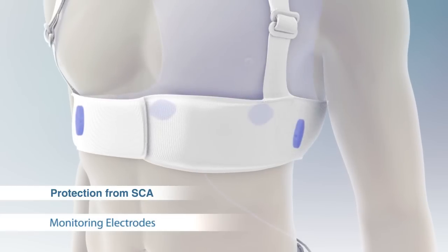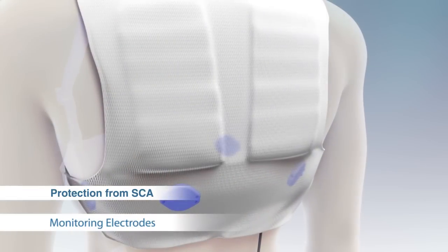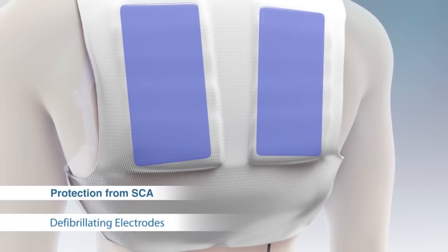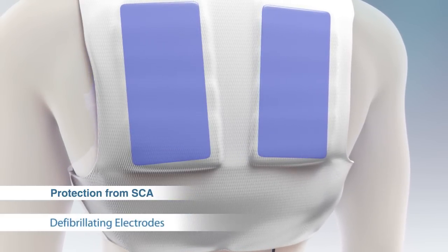Electrodes are contained in the belt around the body. ECG electrodes continuously monitor the heart rhythm. Therapy pads deliver treatment shocks to the heart when necessary.